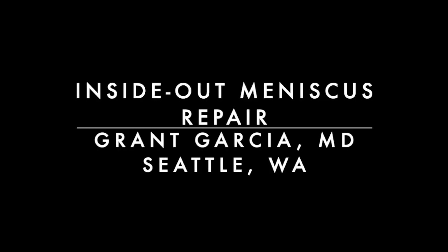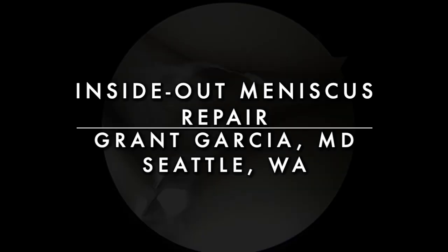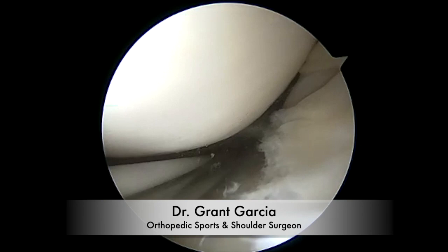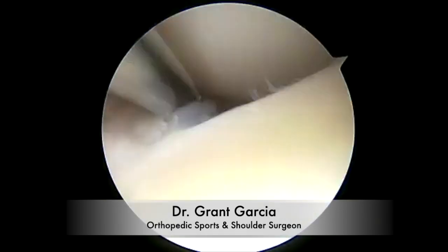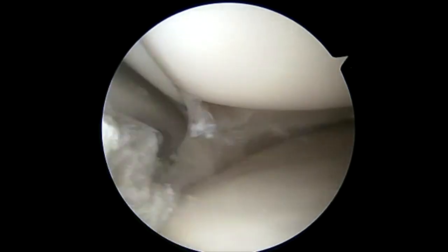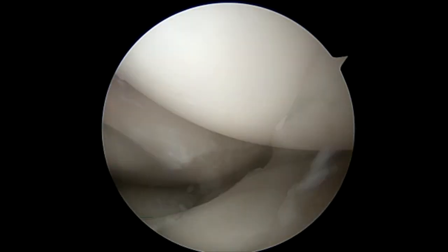We're going to demonstrate our inside-out repair technique for a bucket handle meniscus tear. Initially we use a ball rasp to clean the base of the capsular meniscus. We leave it in the bucket handle position, which allows for easier cleaning.